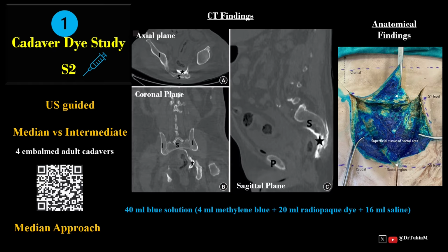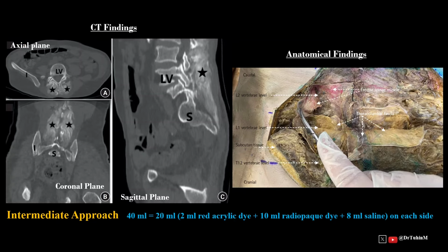Here you can see when the surgery is limited to the sacral area or the coccyx, that you can think about this transverse probe placement and depositing the drug. Why I prefer the intermediate sacral crest approach is when you deposit the drug, even with the cadaveric study, it was proved that the drugs can spread up to L2 or L3 level.